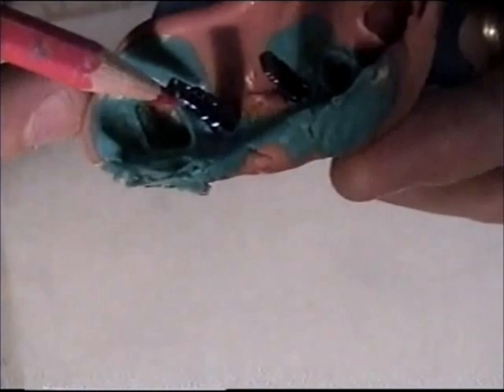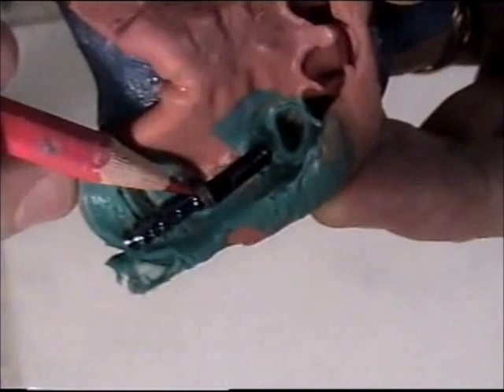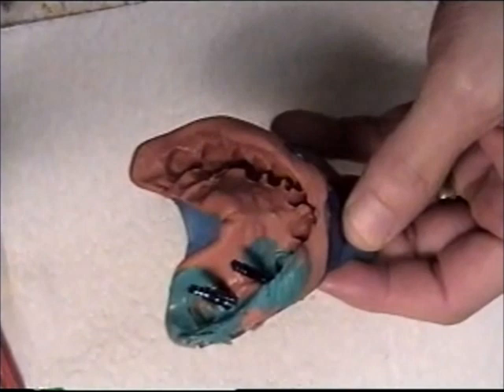Now I have to concentrate on where I want to put my silicone soft tissue. I want to place it right up to where the analog starts, which is right around here. Right around here. Before I pour the silicone around my analogs, I'm going to spray them with a release agent. And I like to blow them off a little bit.